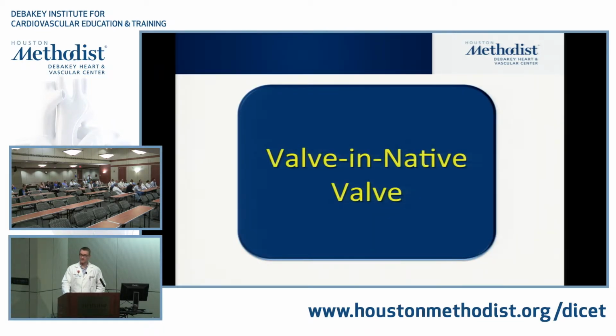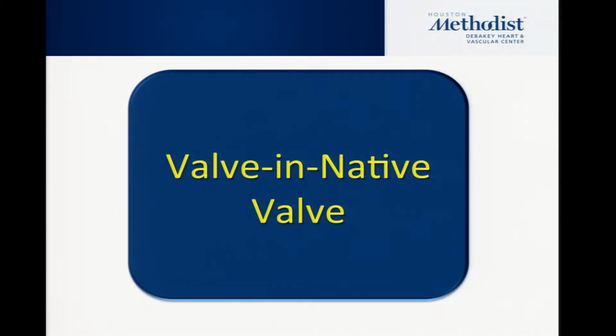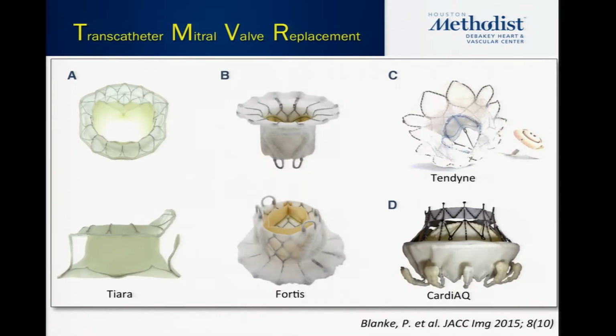All right, so in the last couple of minutes, I'll just show you the valve in native valve, which is what probably most of us mean by TMVR, but not all of us, which is why I showed you the other cases. So these are the devices. This is a partial list of the devices. None of them are on the market, but all of them are being evaluated in some capacity in research trials. So some will make it to market, some have already died.